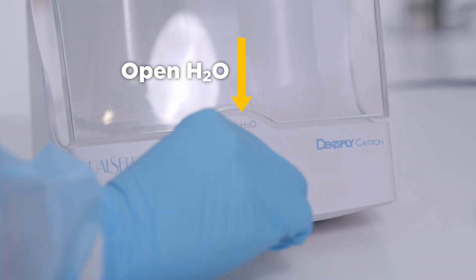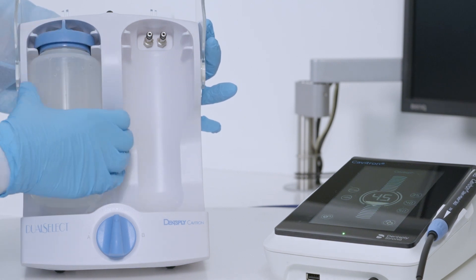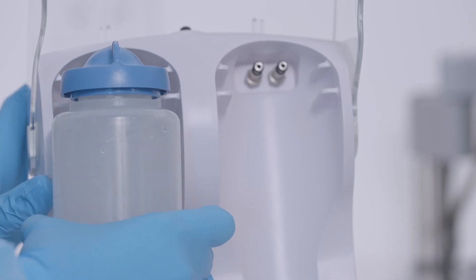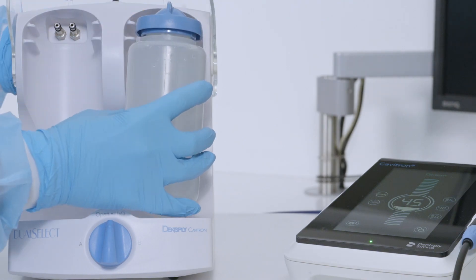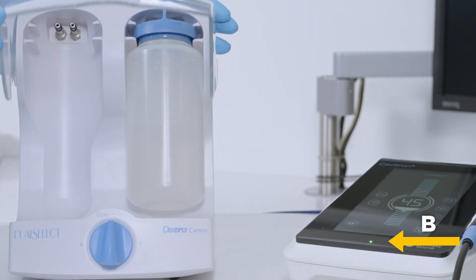Set the selector knob to open H2O position. Open the shield. Remove the clean water bottle from position A and place it in position B. Close the shield and set selector knob to B.